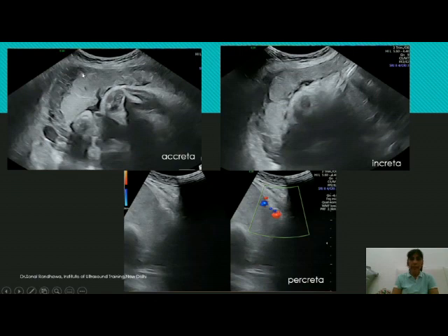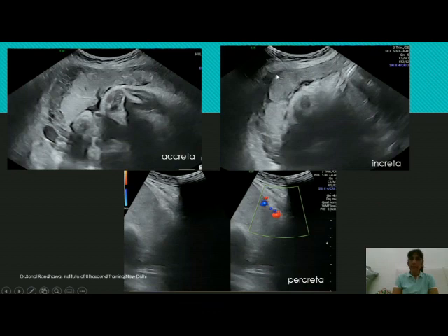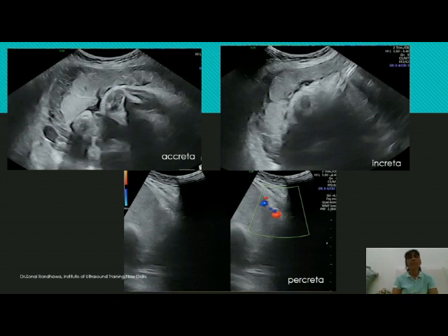Moving to another area in the same patient: here the serosal layer is barely visible, and you could previously see the retroplacental space clearly, but here it has totally disappeared — you cannot see it at all. This would usually be placenta increta, and sometimes even in percreta you may see such a picture, because many times you may not be able to differentiate between the two.